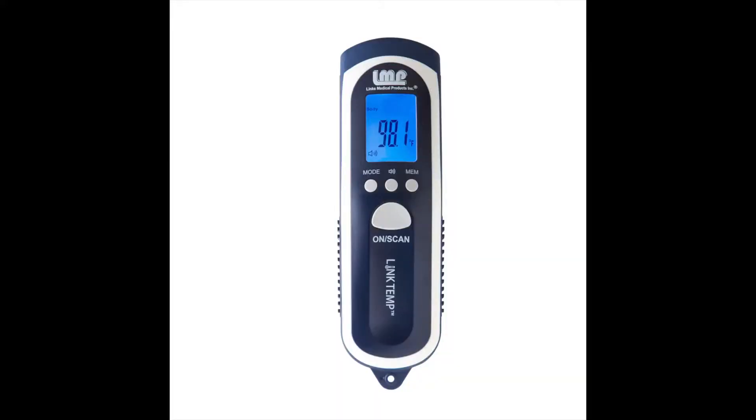Important components on the LinkTemp Non-Contact Infrared Thermometer are the two color LCD screen, the on/scan button, the mode button, the audio on/off button, and the memory button.